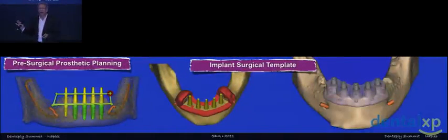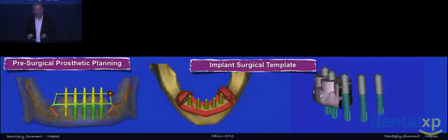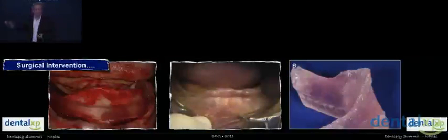There is no comparison between anything that is out there today and what you're seeing on some of the images that I'm showing you right now. And so having this capability, we also need the hardware tools to deliver the implants exactly where we have planned them. And we have them. This has been proven. But there are still some complications and inaccuracies that have been pointed out.